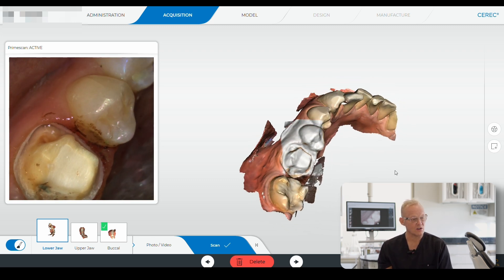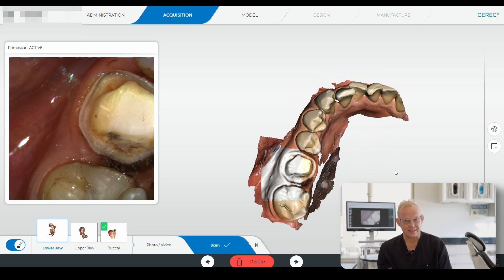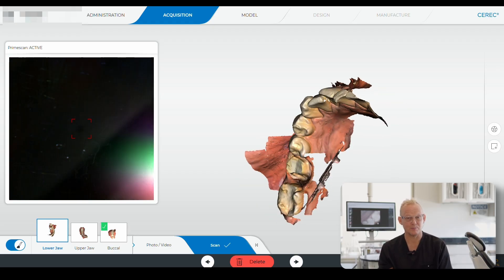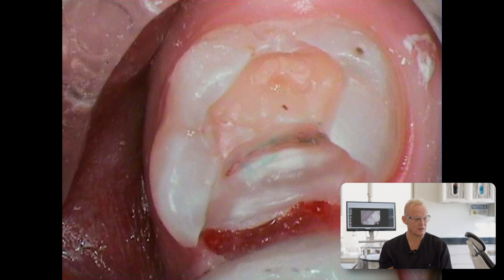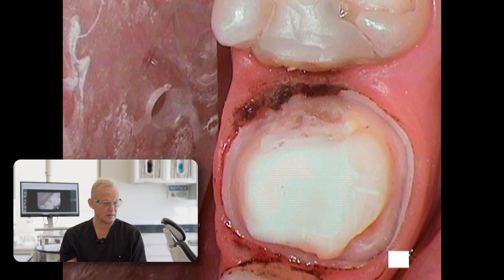These scans are wonderful — you can prepare the tooth, scan it, and make the crown the same day. It's a great service for patients with a busy schedule who don't have enough time or don't want the discomfort of a temporary. You can see the preparations on these teeth with a lot of tooth structure missing. We're doing partial crowns, which save the natural healthy tooth structure that's left.